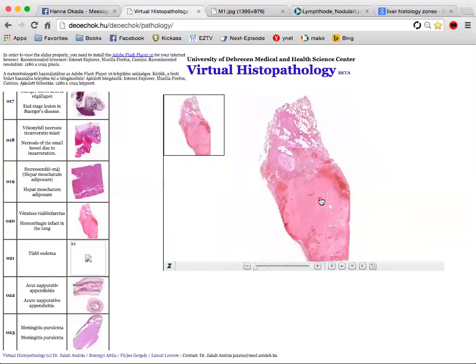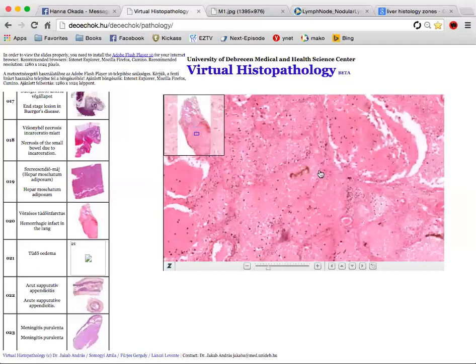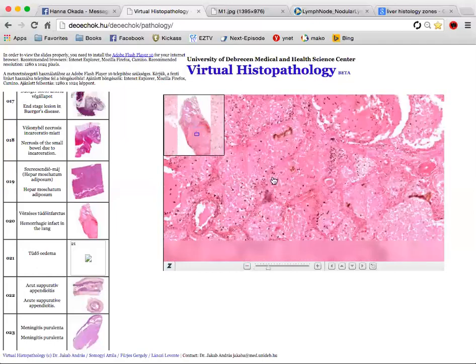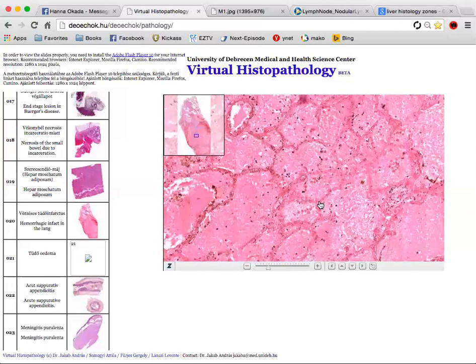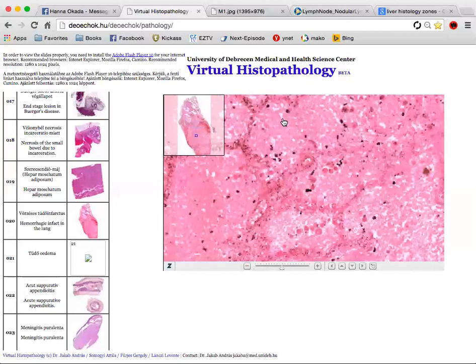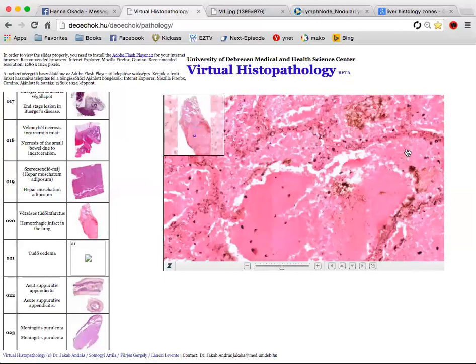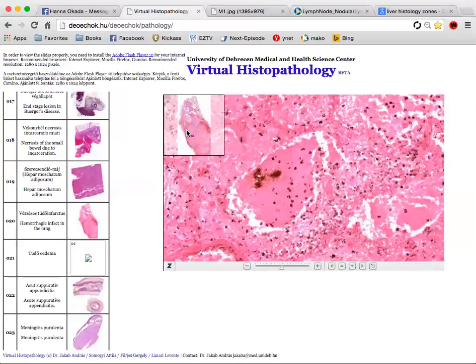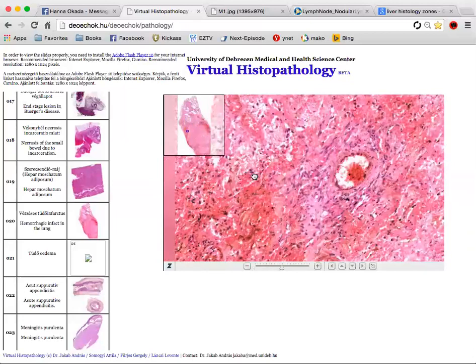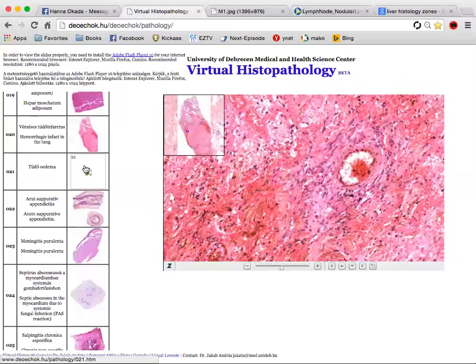No, it's all infarcted. I'm going to go in here, and the darker areas just have more red blood cells in them. But this is all dead tissue. It just has less red blood cells in it. It just depends on where the blood vessels are. So maybe here there's a larger vessel, and that's why it's bleeding more. Okay, all right.